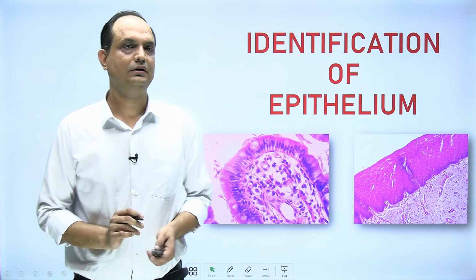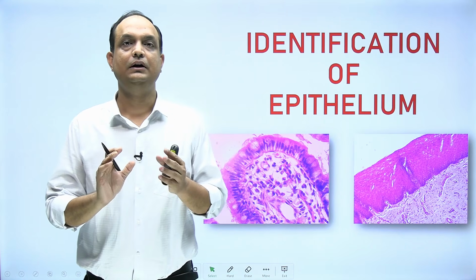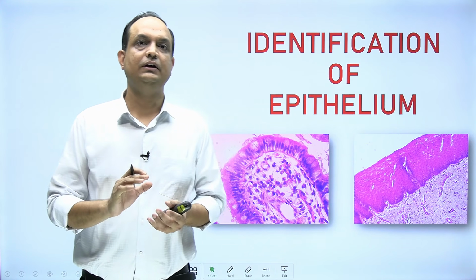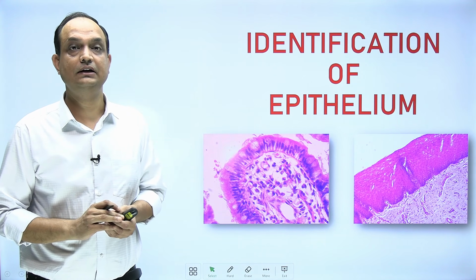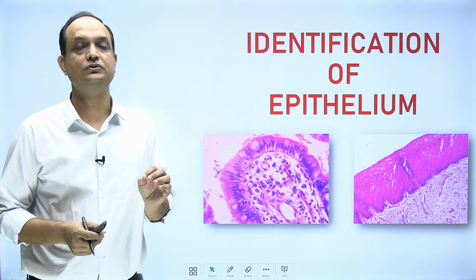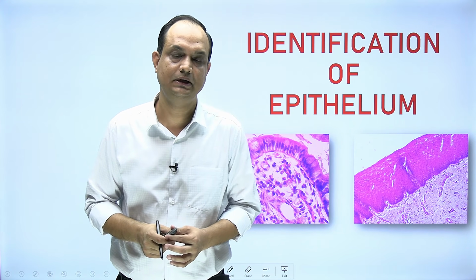Hello students, today we'll discuss the identification of different types of epithelium in your exam. Whenever you have histology slides in your practical exams, this is the most challenging issue for students: how to identify the different types of epithelium.